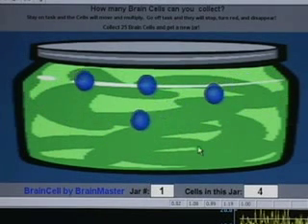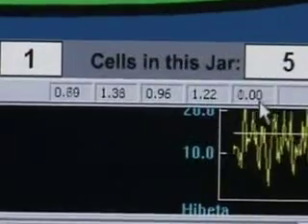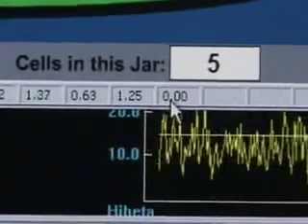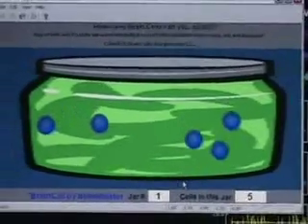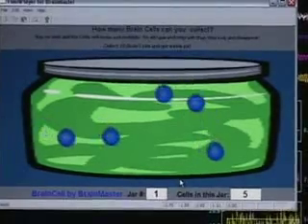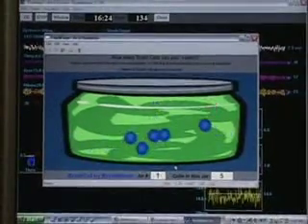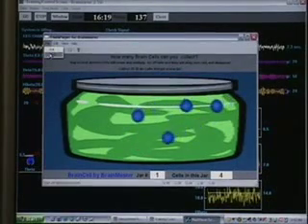The event wizard can be set up with any combination of variables — anything at all that allows this value to become one or zero in an appropriate fashion will control this game. So it's possible to use this game for anything, including not just amplitude training but coherence training, variability training, ratio training, asymmetry training, or any kind of protocol at all. Let's go back to Open and choose the Brain Man game.